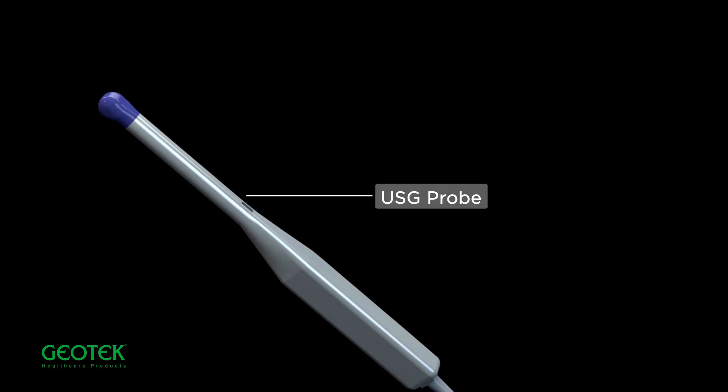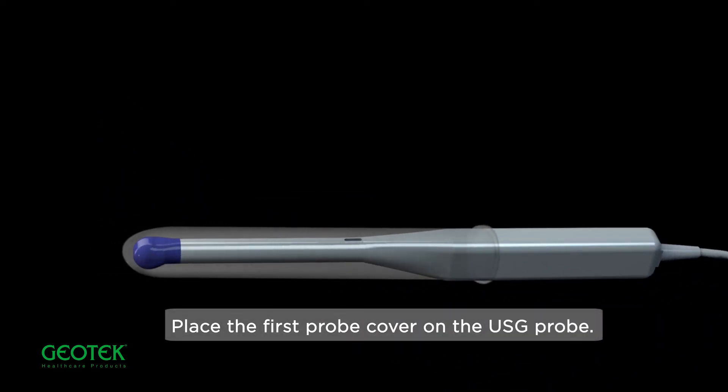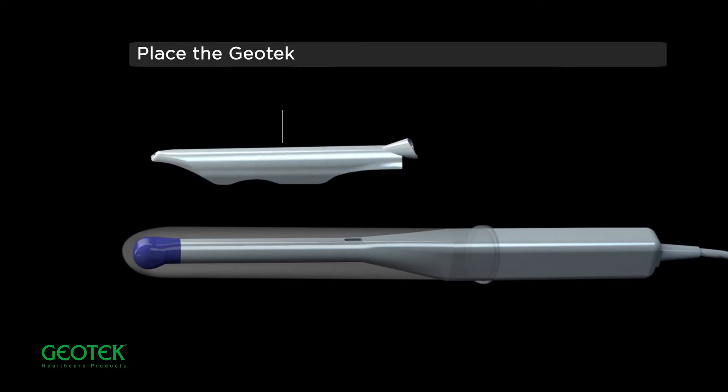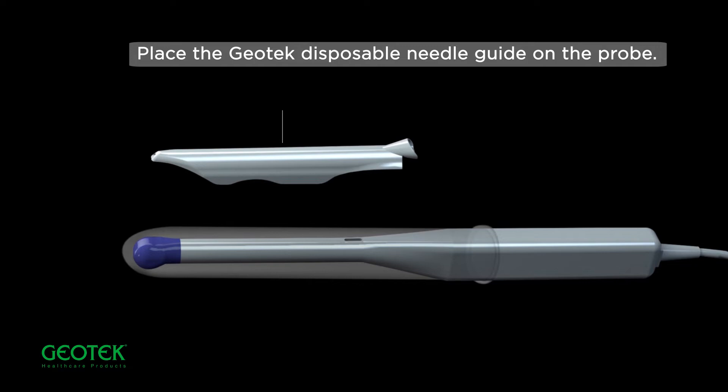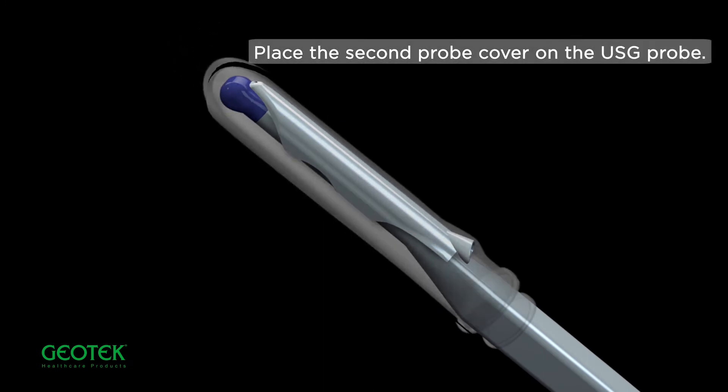USG Probe setup: Place the first probe cover on the USG probe, then place the Geotech Disposable Needle Guide on the probe, followed by placing the second probe cover on the USG probe.